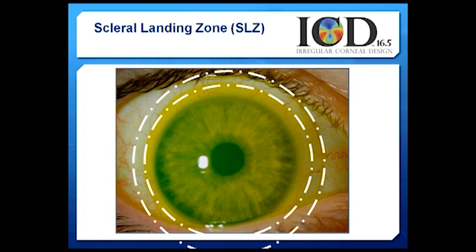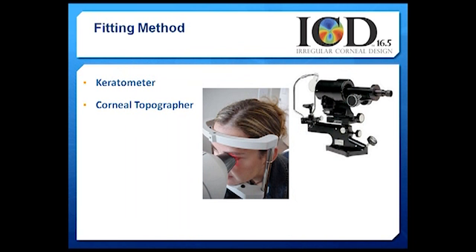The next zone in the lens is that scleral landing zone that we talked about earlier. And what we're looking for here, again in white light, is that the fluorescein molecules appear to bleed through past the cornea, past the limbus, and onto the sclera, and then our ICD lens lands out toward the periphery where you see the white. So the lens is landed with all its weight and pressure out on the sclera here. And you'll notice that white where we've pushed the fluorescein molecules out and allowed our lens to land and sink into that boggy conjunctiva.